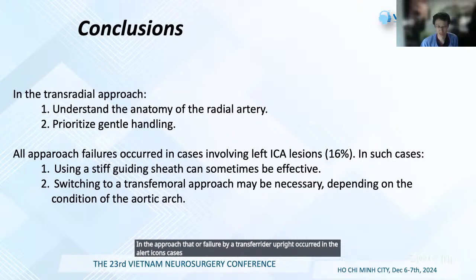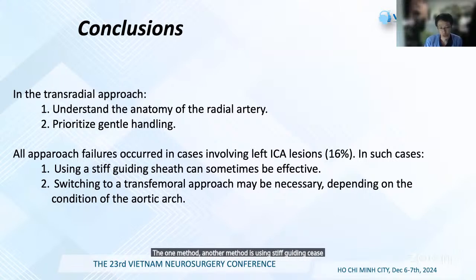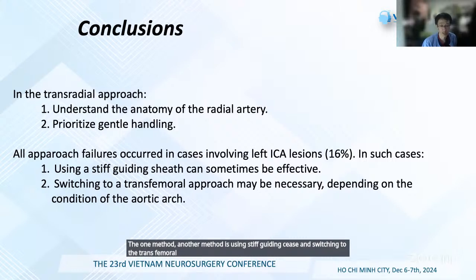In such cases, another method is using stiff guiding sheaths, and switching to the transfemoral approach may be necessary depending on the condition of the aortic arch. Thank you.